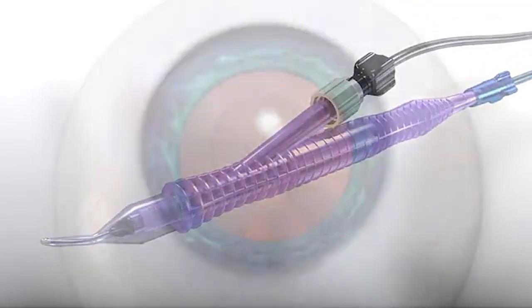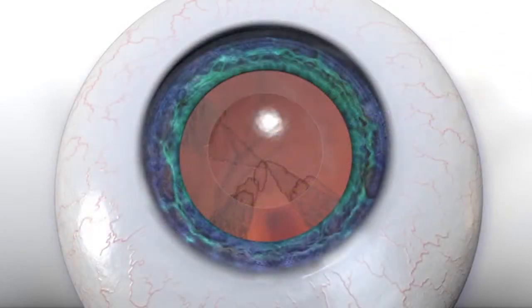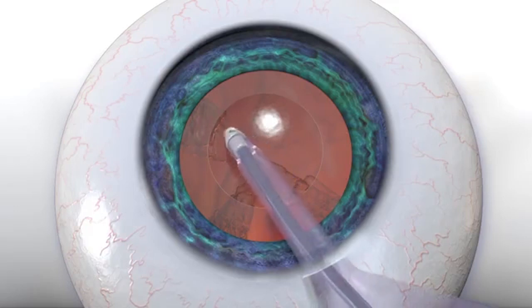When used in coaxial mode, the handpiece has all the advantages of the Alcon Intrepid Polymer technology, designed to provide a smooth, capsular-friendly tip.